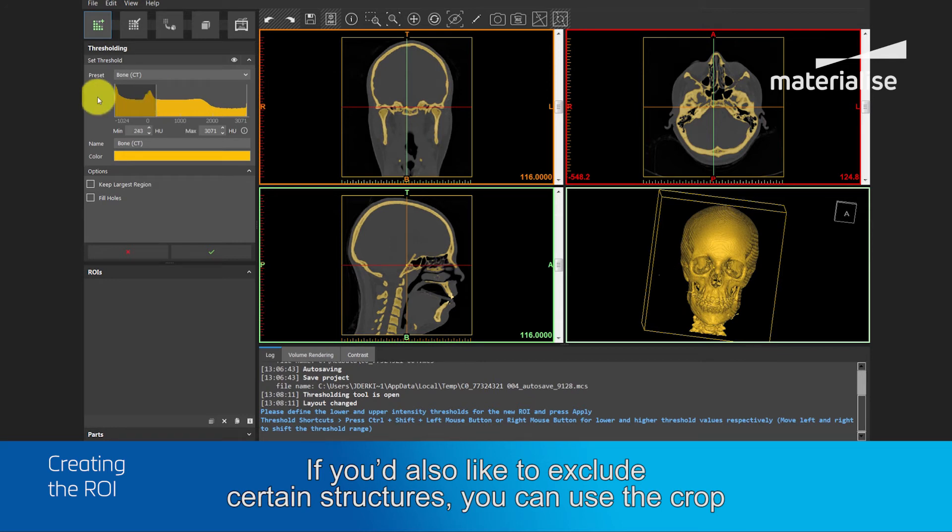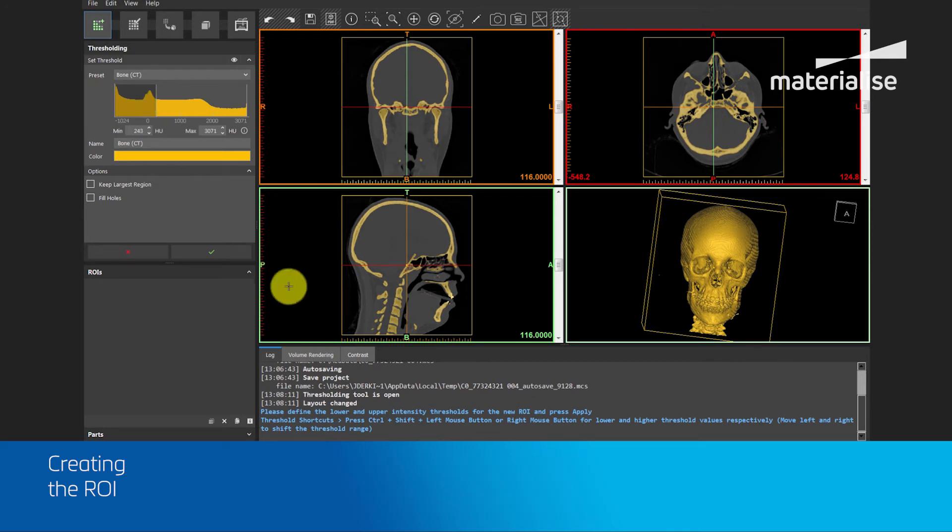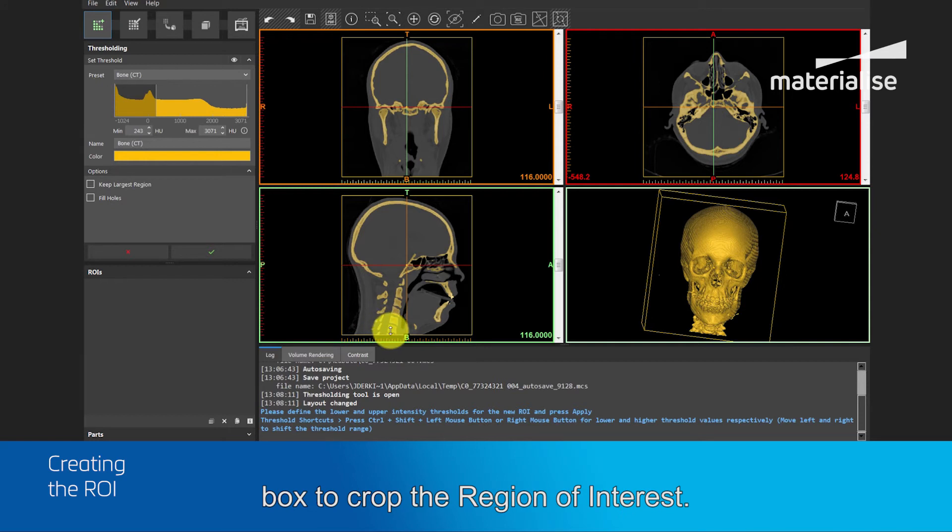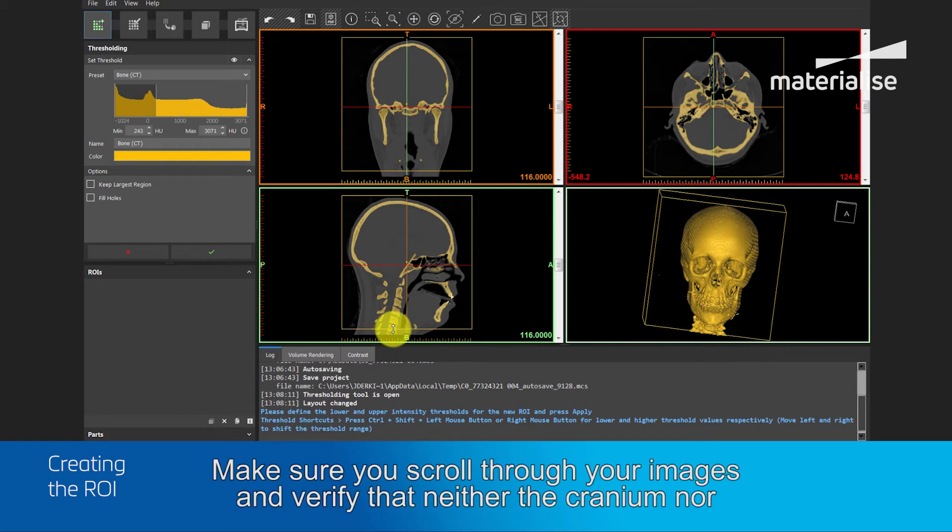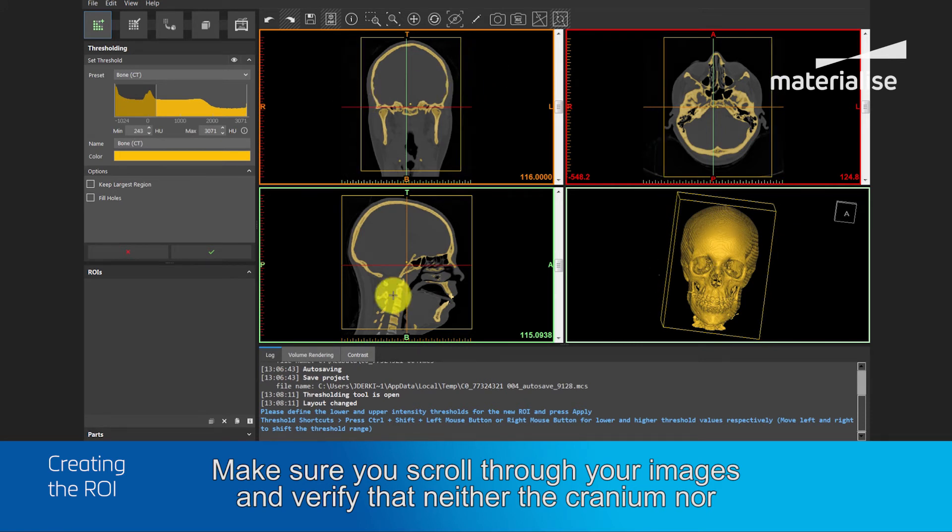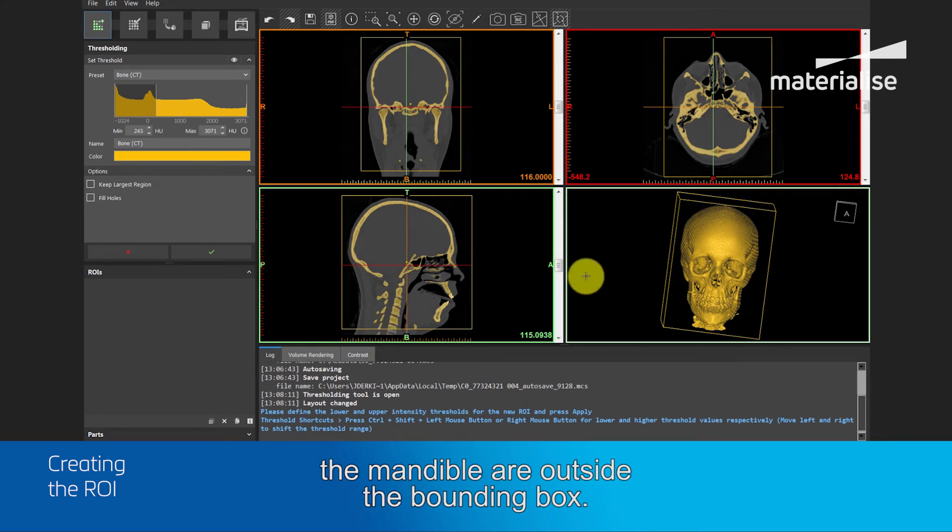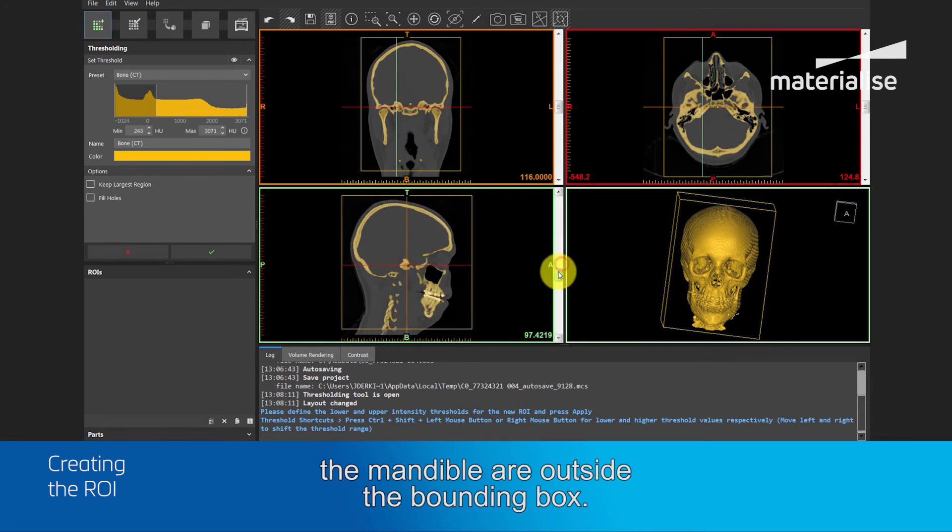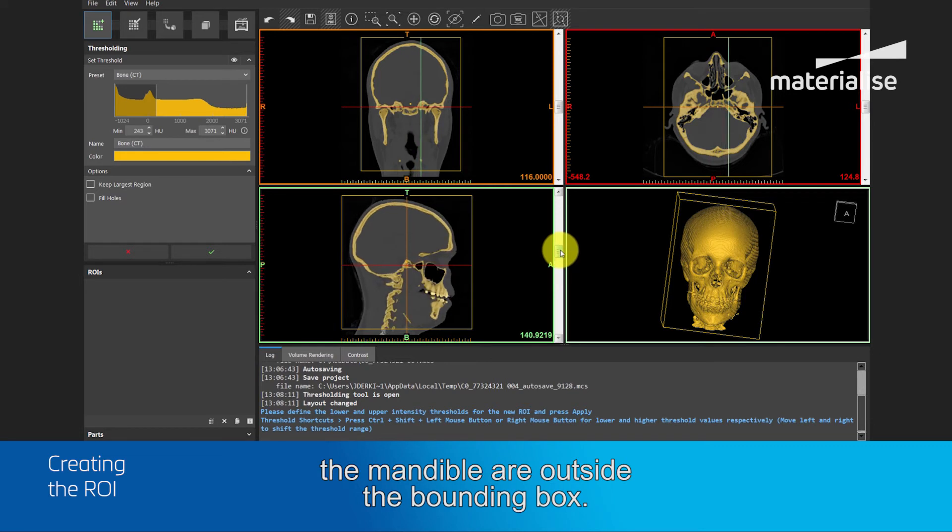If you also like to exclude certain structure, you can use the crop box to crop the region of interest. Make sure you scroll through the images and verify that neither the cranium nor the mandible are outside the bounding box.